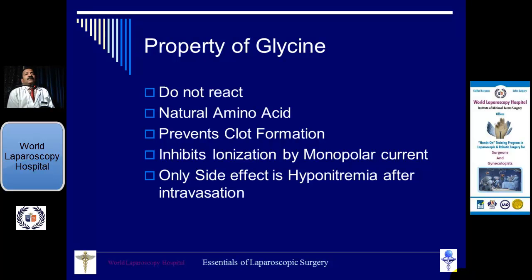Another is pressure. If pressure is more, there will be more intravasation. So you should limit the pressure to 150 to 180. If pressure is more, there will be more intravasation.